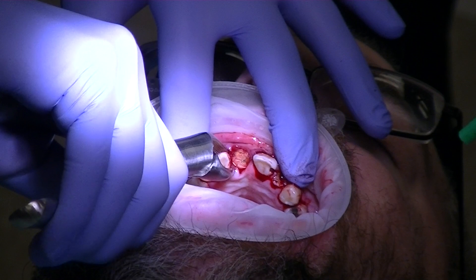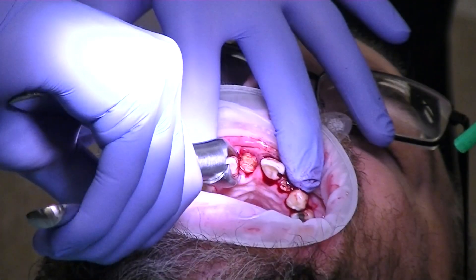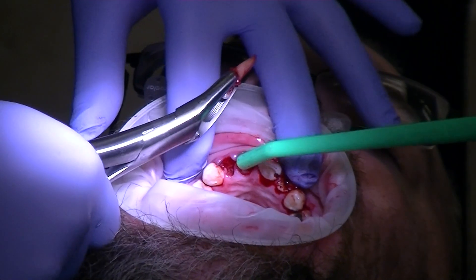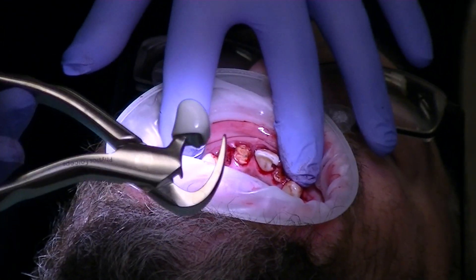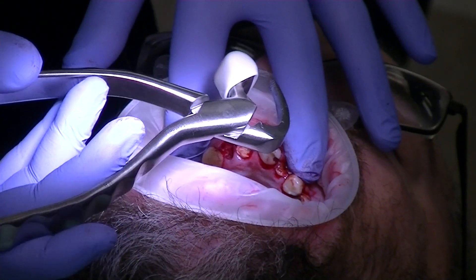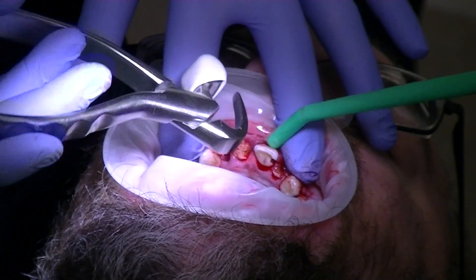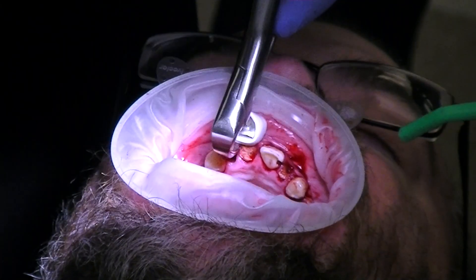When you take this out, I don't recommend going buccal-lingual. What I recommend is you push apical — it expands the socket — and then twist, and you're going to find it comes out really easy. Now the physics forcep normally has a green bumper; they made extras in white for the demo, not a problem. We're going to position it right up here.